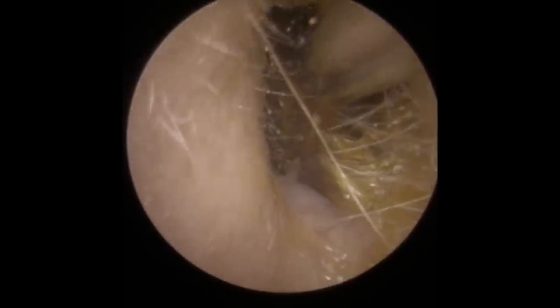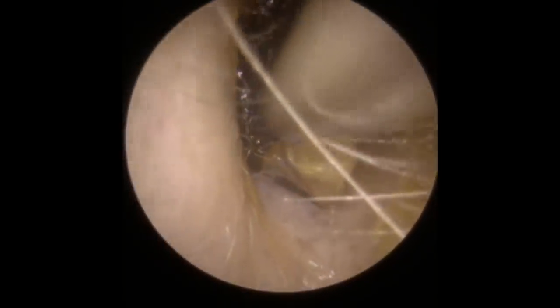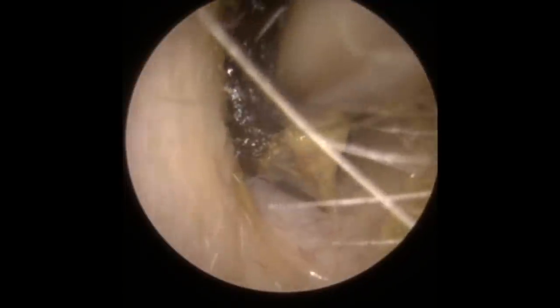You can see it's actually quite a large piece. It's wedged quite firmly there in the canal entrance. Just wiggling it up and down helps to loosen it off the canal wall so we can get that out a bit more effectively. A little bit of dry skin lifting here. Look at the base of the canal. You can see just flicking up towards the suction.